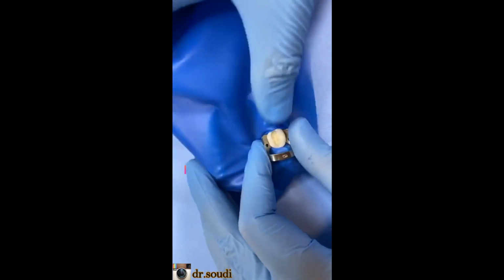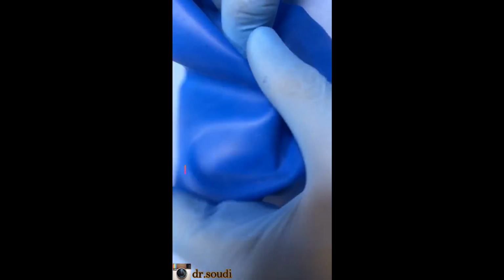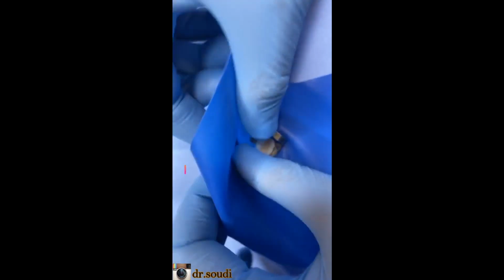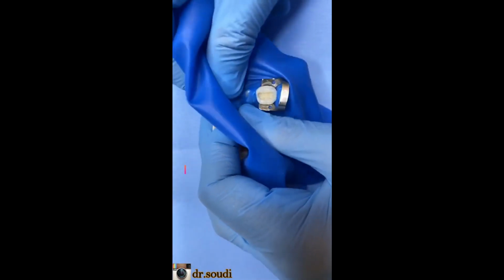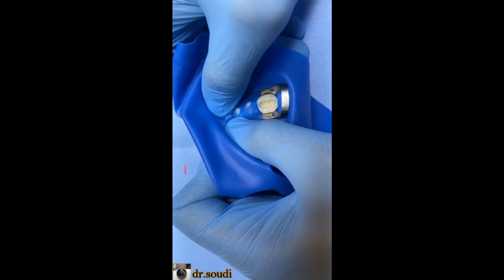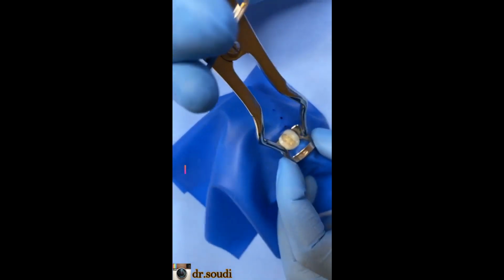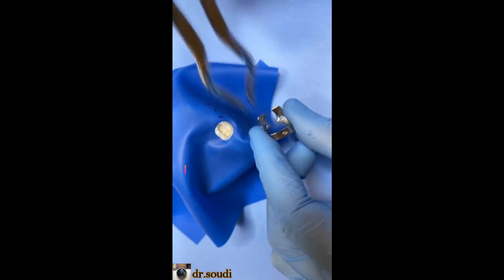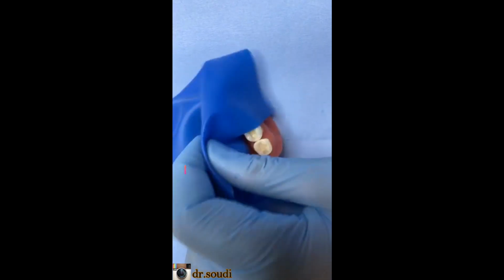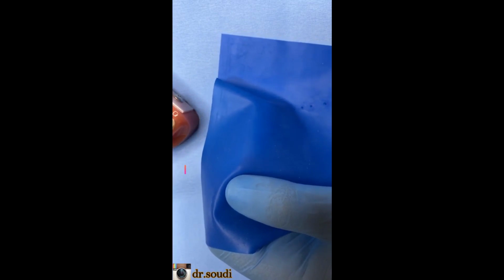Now you have your clamp, then continue to the other teeth like this. Sometimes you need an assistant. I never use an assistant with me, but the cost is moving, so sorry for this. You will pass your other teeth. We will do it again. Okay, this one is called the bow technique. For the wingless clamp, there are no wings. If we have a winged clamp, earlier in the first live we talked about winged and wingless clamps.